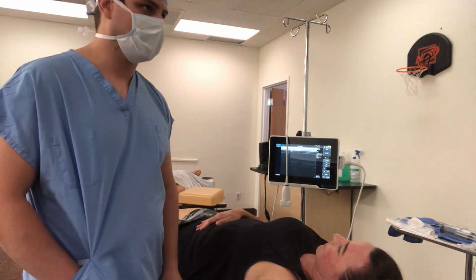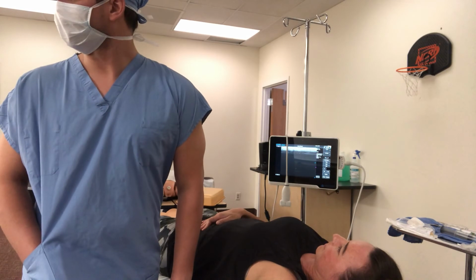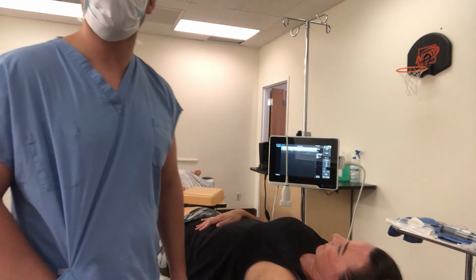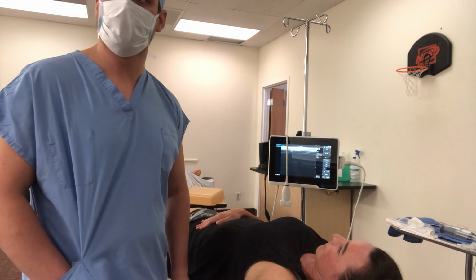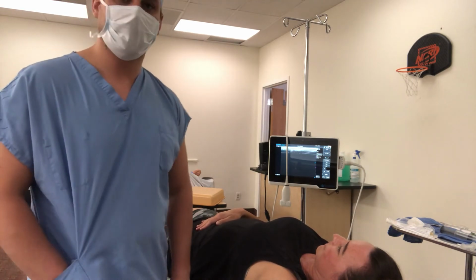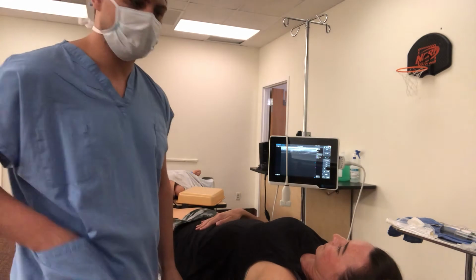She has an IV. We gave her some medication for sedation, which will be 50 mics of fentanyl and 2 milligrams of Versed, and if she has more pain, we can give her an additional 50 mics of fentanyl. So she's set up on the monitor. I have my equipment. I've gathered my needle, which will be a little bit longer, and I have my assistants.